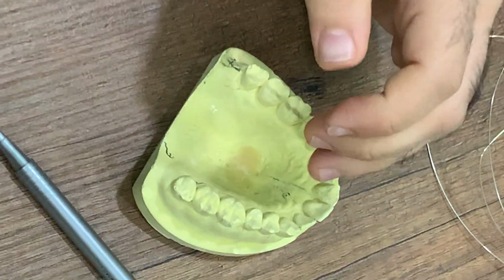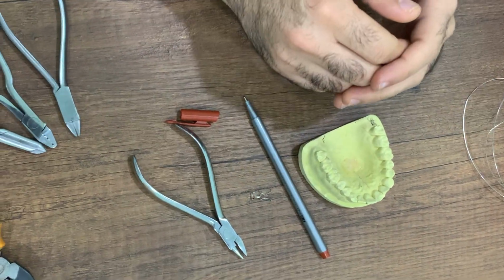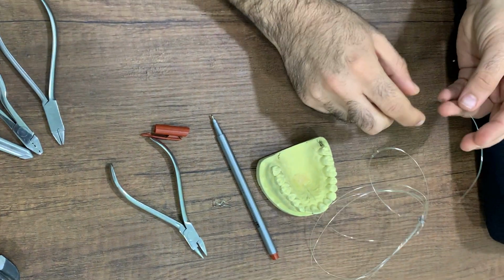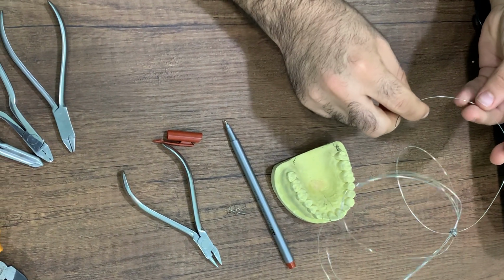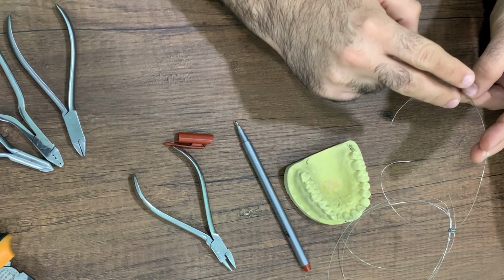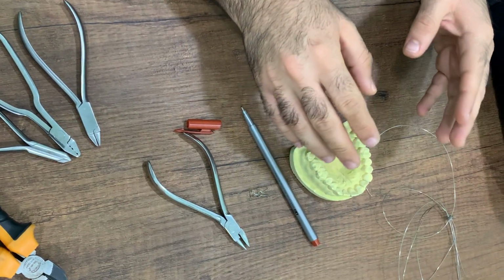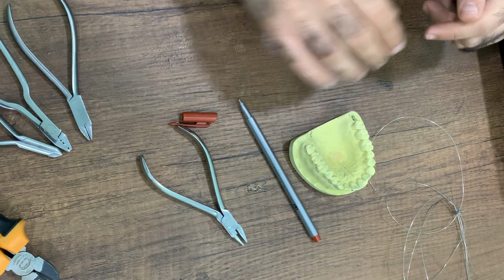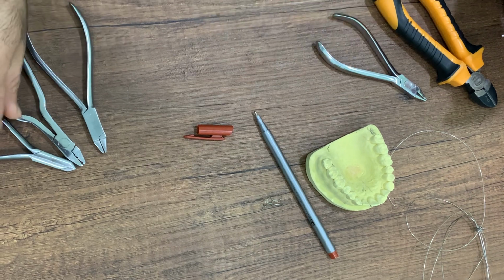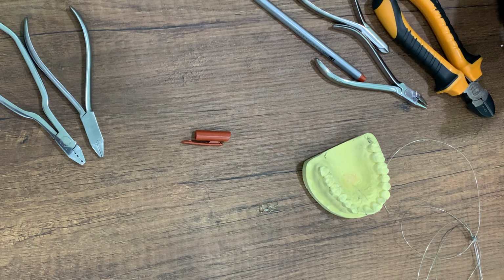Okay, now I'm going to show you how to construct the T-spring. Firstly, you will need to make the T-spring. In this lab you will need a cutter, an angle plier, a 3-prong plier, and a marker.